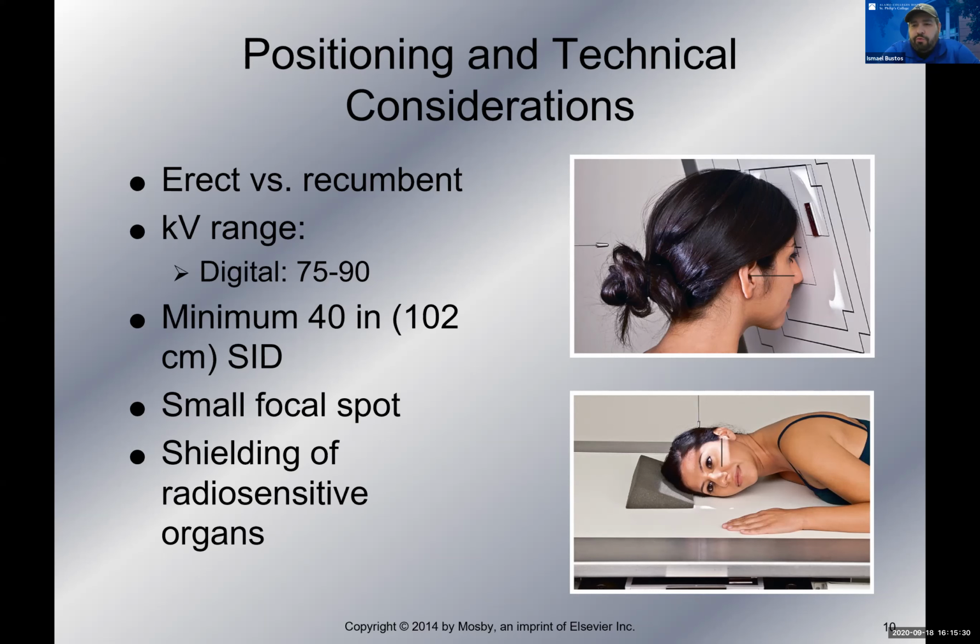And then, of course, since we're doing projections of the skull, we're nowhere near the gonads, but we need to make sure we are shielding the patient. That should be done on every single patient for every projection, unless the shielding gets in the way of the anatomy. So you need to start practicing shielding every patient. It doesn't matter age, it doesn't matter what projection you're doing. Again, try shielding on every patient.